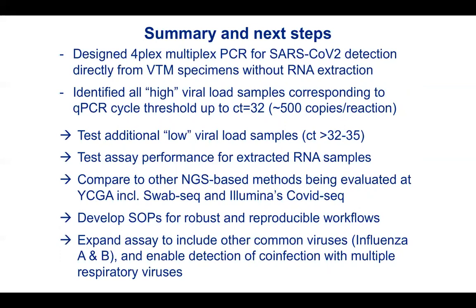The assay can be expanded to include other common viruses, for example, influenza A and B, and to enable detection of co-infection with multiple respiratory viruses.